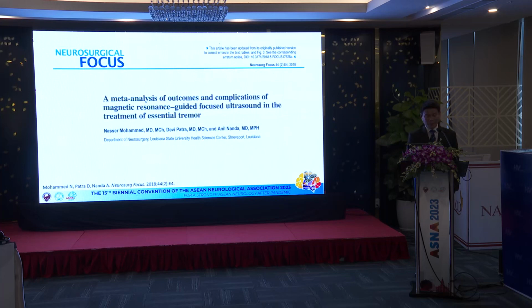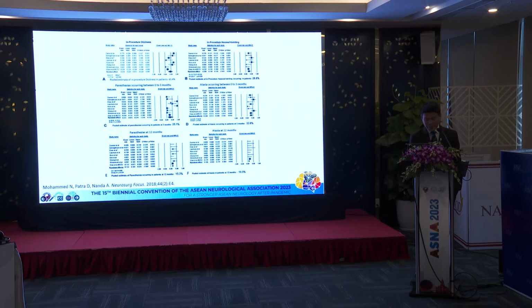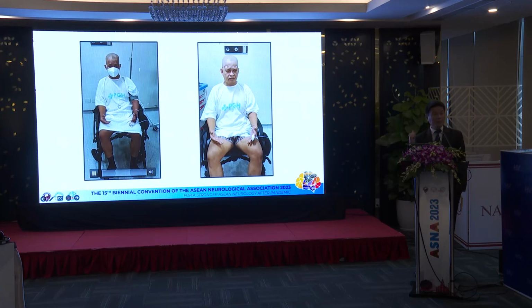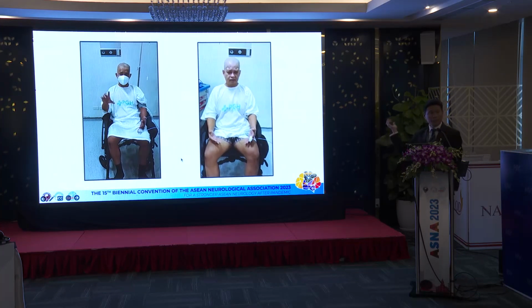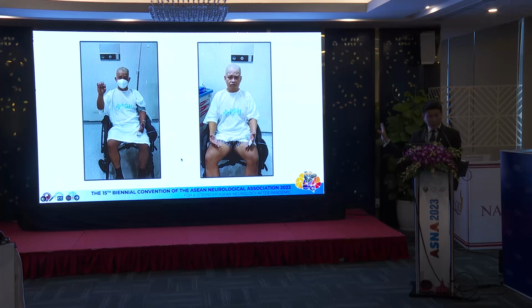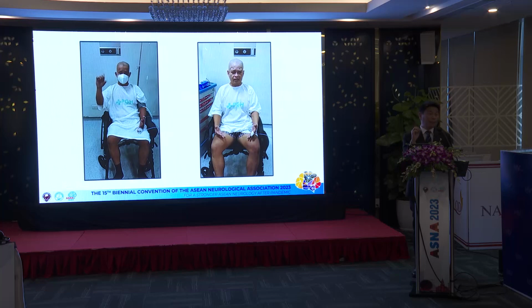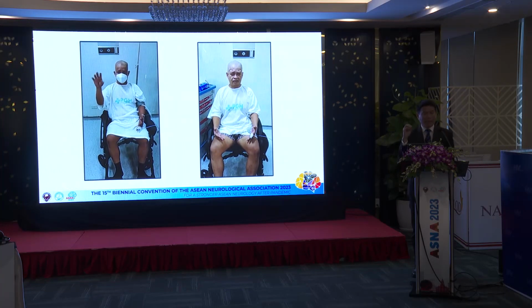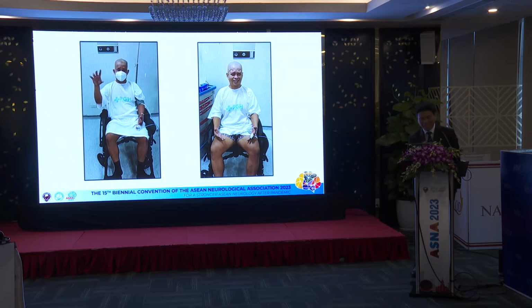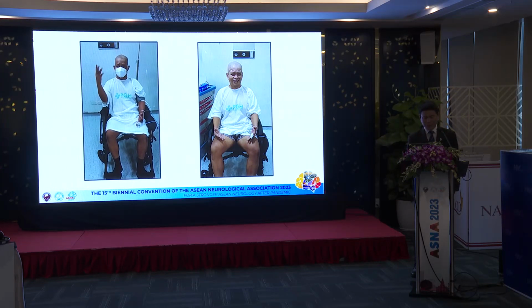So what about the outcomes and complications? Again, there's nausea, there's dizziness. You saw this particular patient, and there's actually improvement of the right hand tremors. Our problem with this particular patient is that the skull density ratio, or the thickness of the skull, was a little low at 0.37. So the patient was complaining of headache after every sonication. But he persisted. So there's really improvement, and it's been 6 months, and so far, so good.